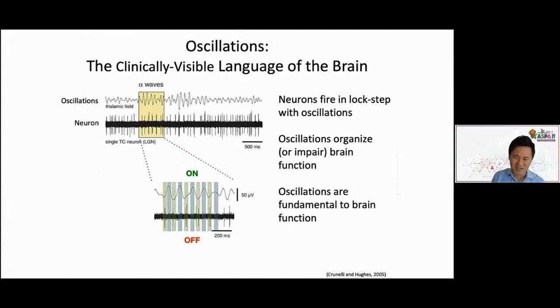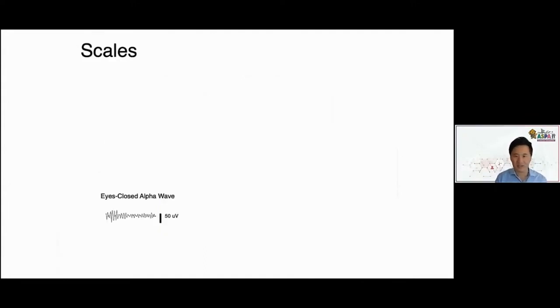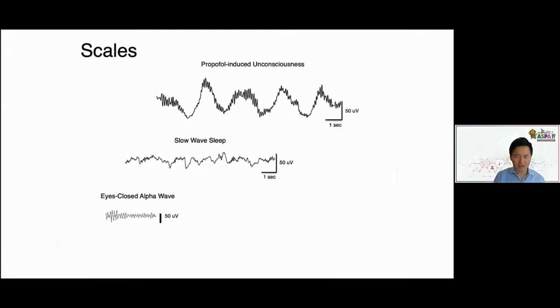If you introduce these large anesthesia-induced oscillations, we're disrupting that activity. And as I mentioned earlier, the scale of those oscillations with the anesthetic drugs is so much larger than endogenously generated oscillations that we're really introducing a quite profound level of disruption. And we'll come back to that inference about the scale of oscillations a bit later.